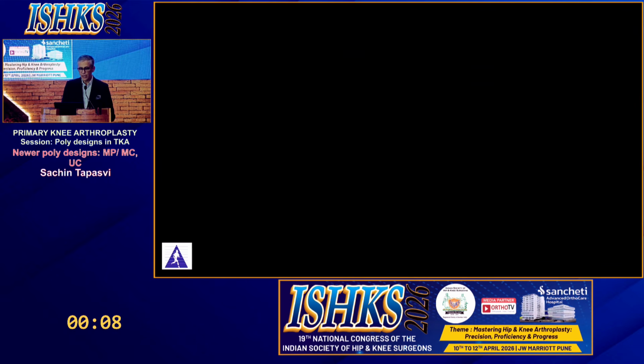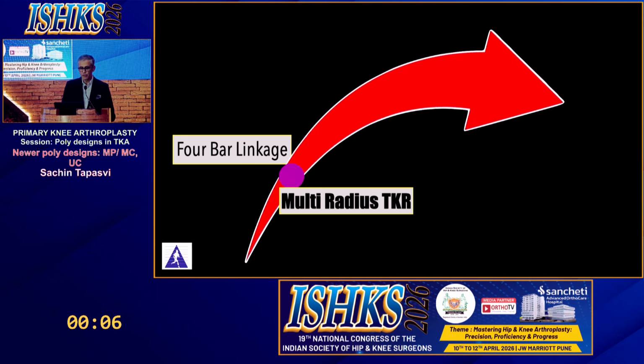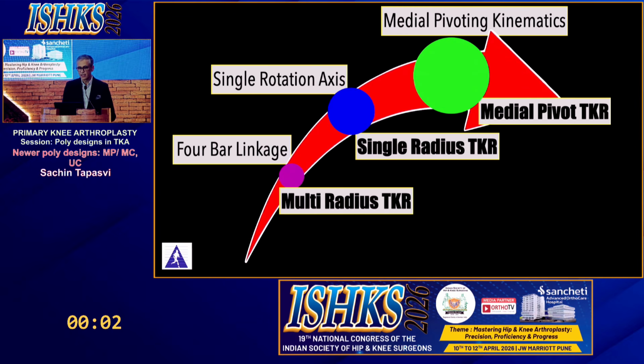So where do we stand today? I think we've evolved with different philosophies. We went from a multi-radius to a single radius, and now we are at the medial pivoting kinematics, and God knows what is next in store for us. We'll probably have another bearing as we continue to evolve our understanding.